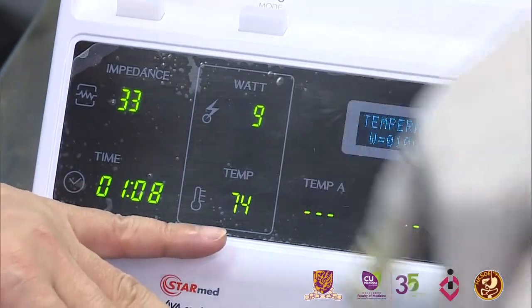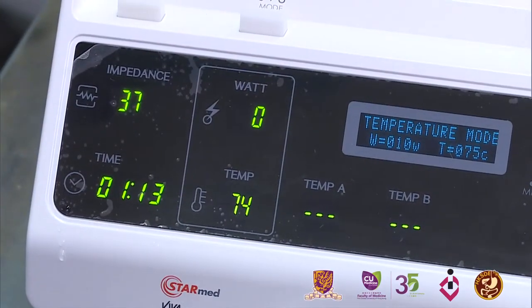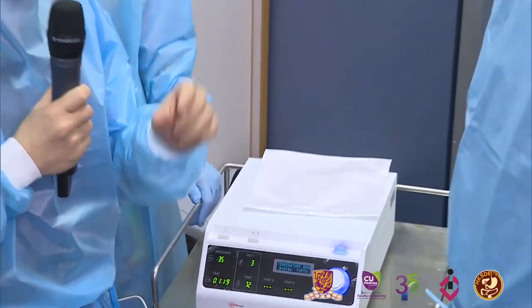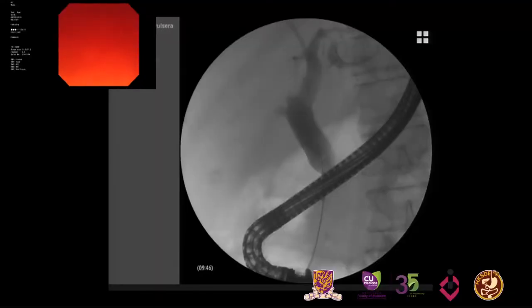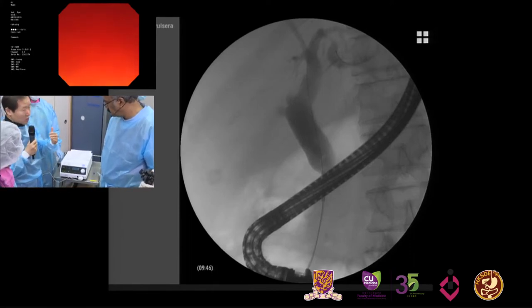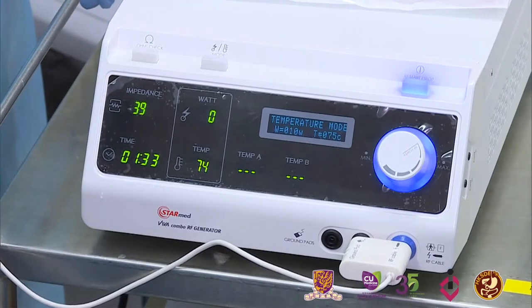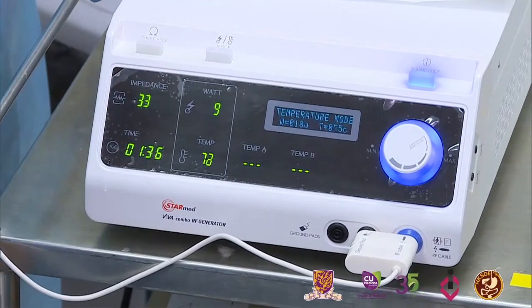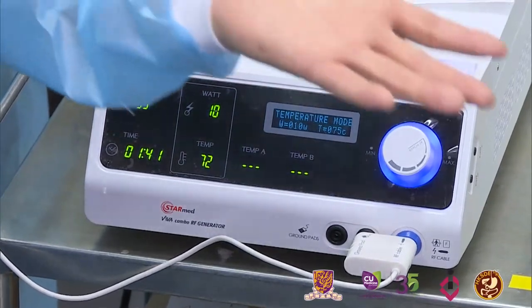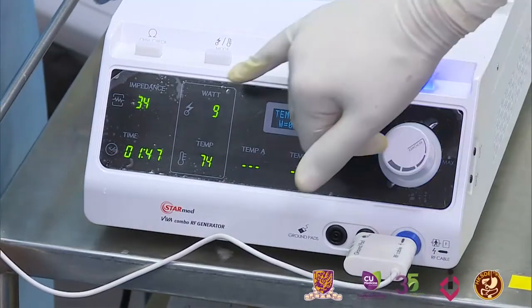Not frying. If you increase the temperature above 100, then the tissue near the electrode will be burned and it causes carbonization. That layer then blocks the further propagation of heat energy, the impedance will increase too much, and the machine will stop. So slower, longer-term cooking is important. Not cooking, which is not a very appropriate term; ablation.